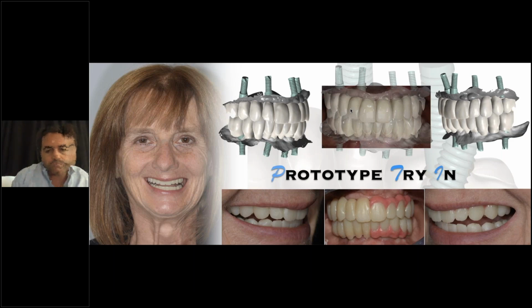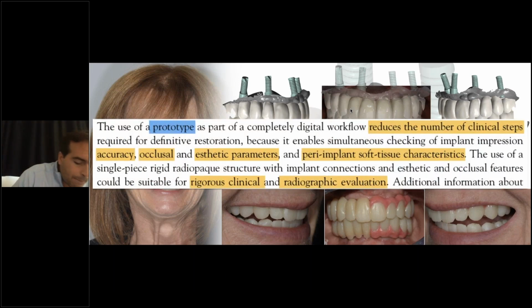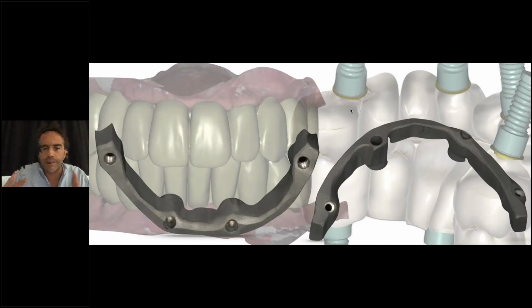The patient can be involved in the decision making of whether we need or we don't need a pink artificial component to maximize the aesthetics. So the PMMA prototypes, especially in full arch restoration, are pivotal to create a rigorous clinical and radiographic evaluation. And we will be extremely happy to offer a full arch digital workflow webinar for you to understand all of these different parameters.